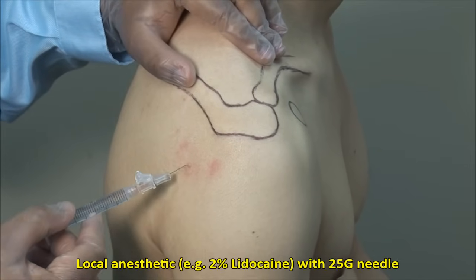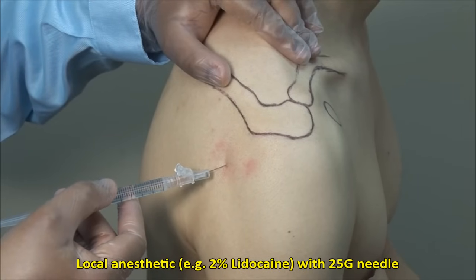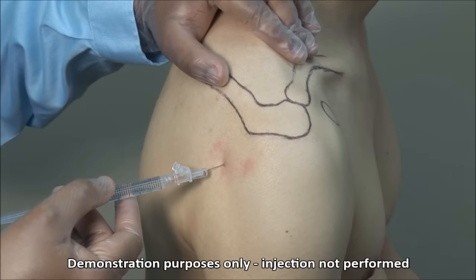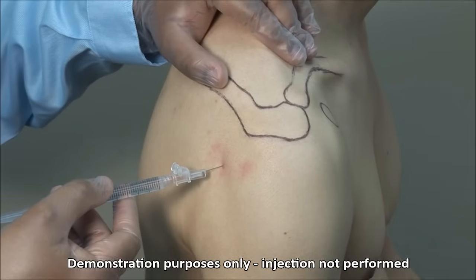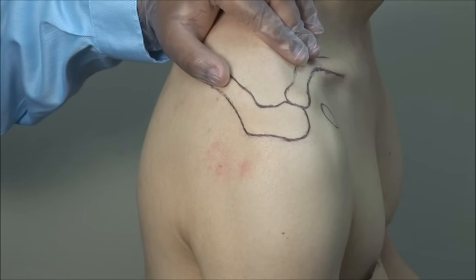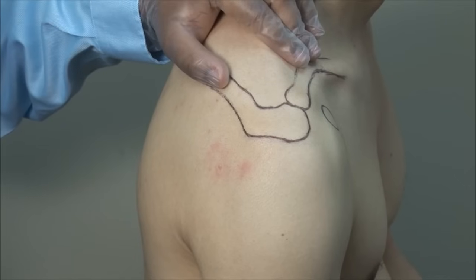Local anesthetic can be applied to the skin and subcutaneous tissue down to the capsule of the joint using a 25 gauge needle. The experienced clinician may forego this if a quick injection is anticipated. If you anticipate difficulty or expect to aspirate fluid, which would take longer, then you should definitely infiltrate local anesthetic first.